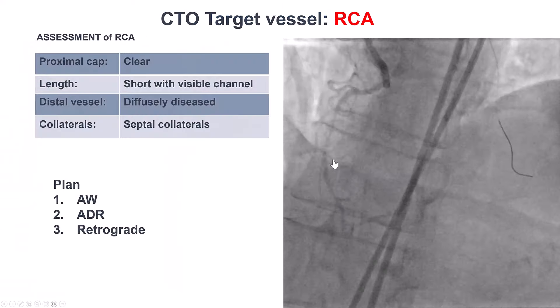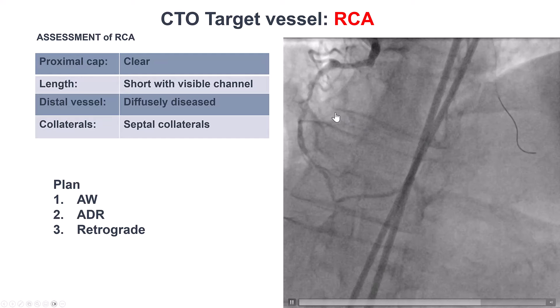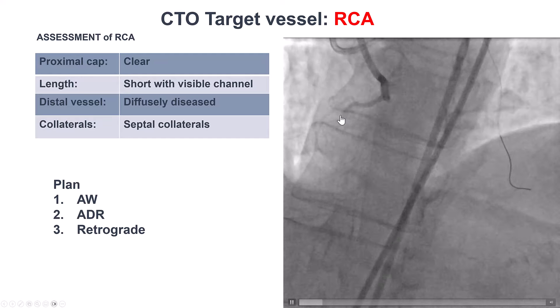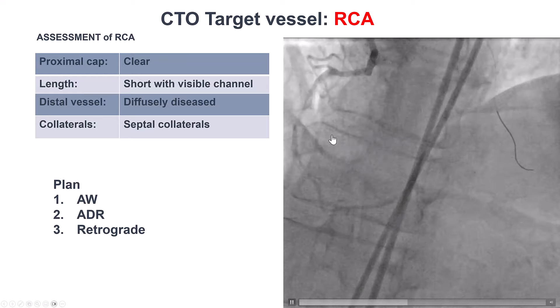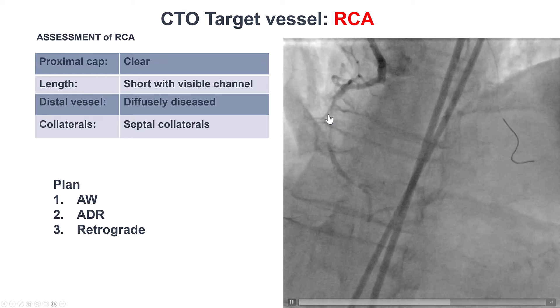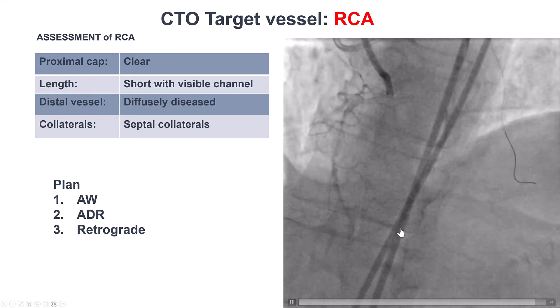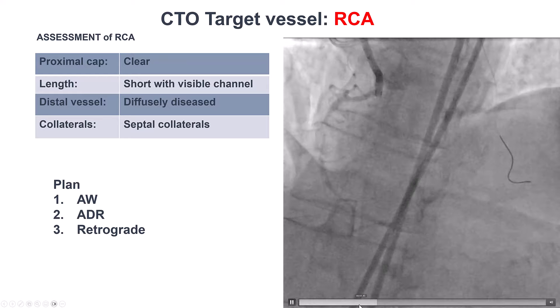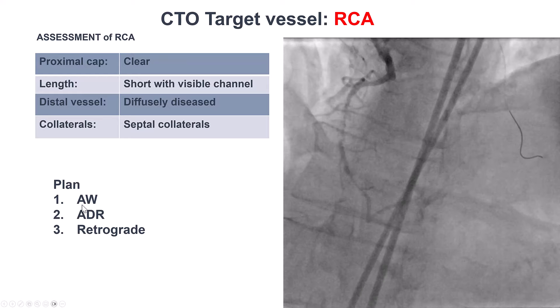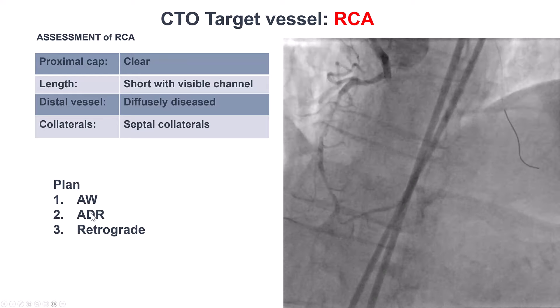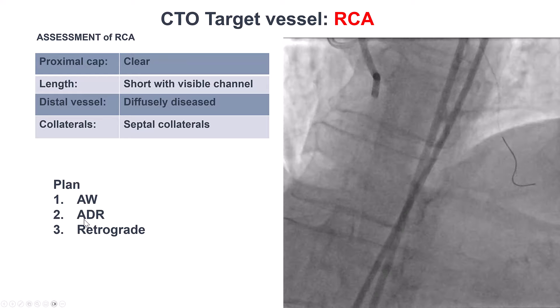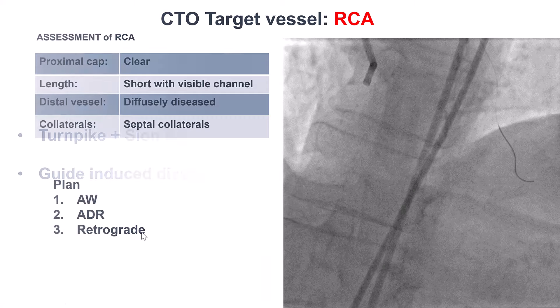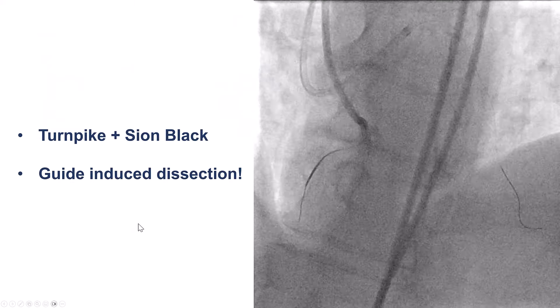Analyzing the lesion, we do have a well-defined proximal cap. As mentioned, there may actually be contrast flow going through the occlusion. The distal vessel is diffusely diseased and there were some septal collaterals. The plan was to go with antegrade wiring, followed by dissection re-entry antegrade, and if that didn't work, go retrograde through the septals.